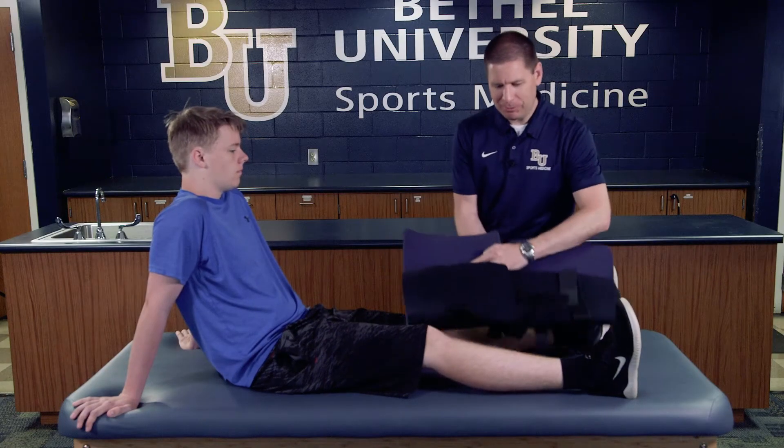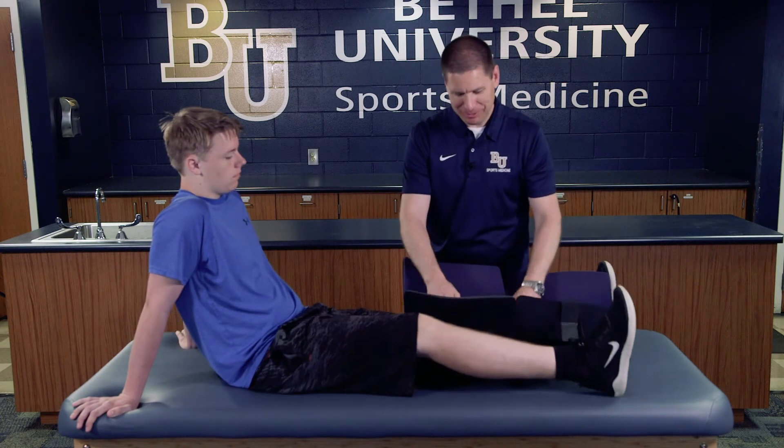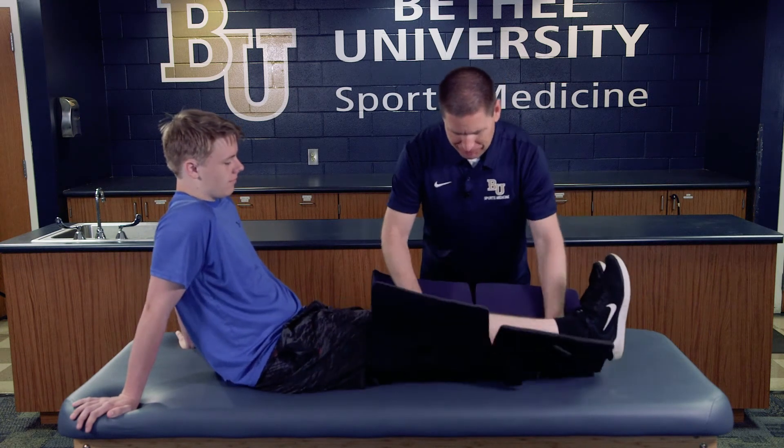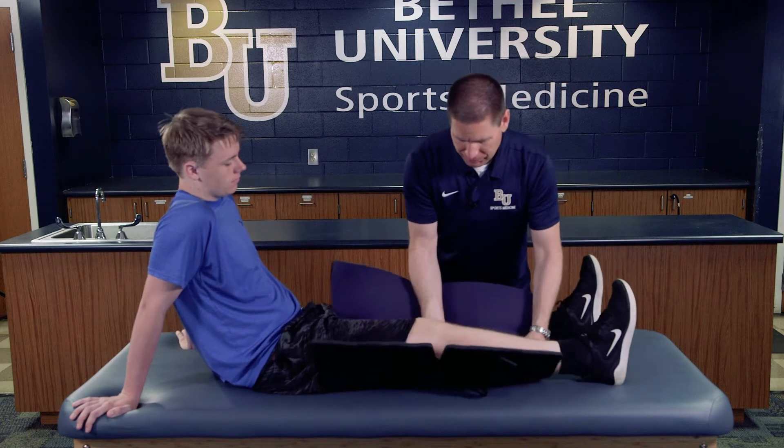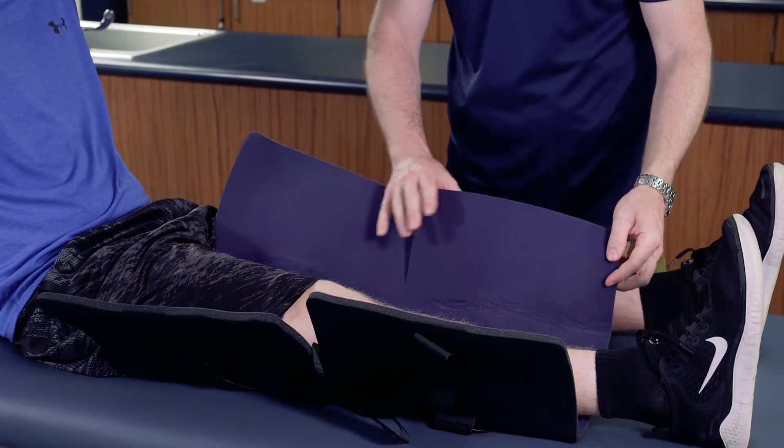Generally speaking, it's helpful to have a partner to raise his leg so it doesn't hurt him, but in this situation we're going to be okay. We're going to place the knee immobilizer with that curved part right behind the popliteal space.